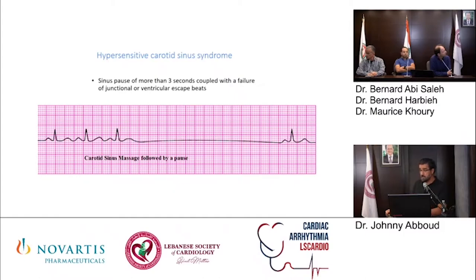And you should do it in a standing position also, because you can have a significant pause or sometimes significant hypotension because of vasodilatation. So if you can try the carotid sinus massage, try it in the standing position. Usually, when we do the tilt test, when we fix the patient on the tilt table in the upright position, we try to do the carotid massage before beginning the tilt table test, to be able to document any significant symptoms, pauses, or significant hypotension.